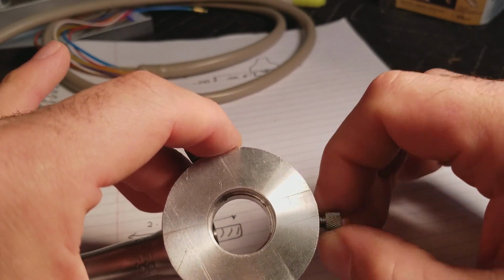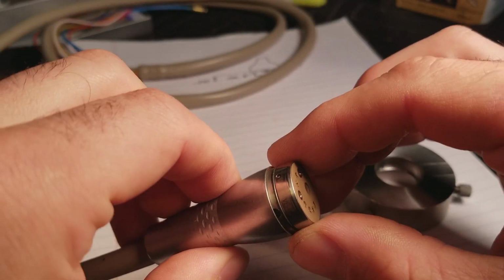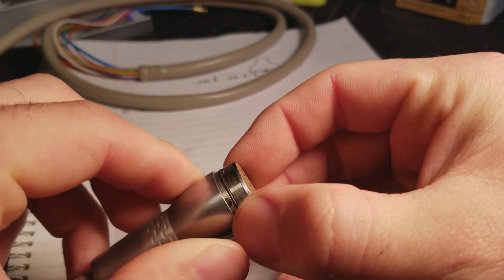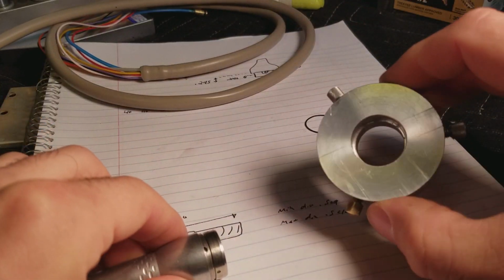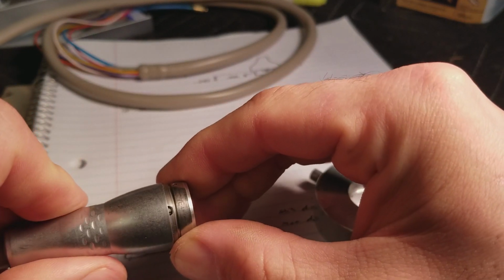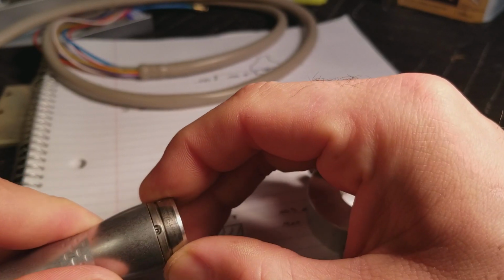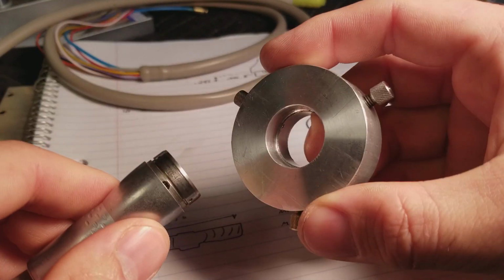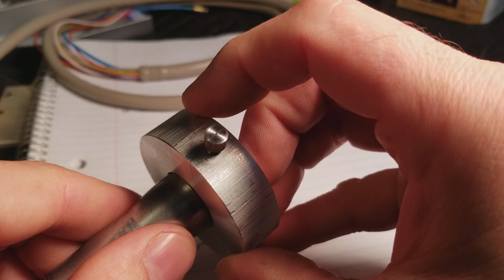So I'm going to show you how I go about taking this apart. Anyway, there's a little rubber O-ring here that you have to take off. So to do that, you just kind of squeeze, and it'll just kind of flip right off like so. Perfect. That's going to be in the way. I then take this, line up that little hole right there, like so. You guys can see it right there. That helps the little pin engage. I then take this piece and just simply put it over like so.